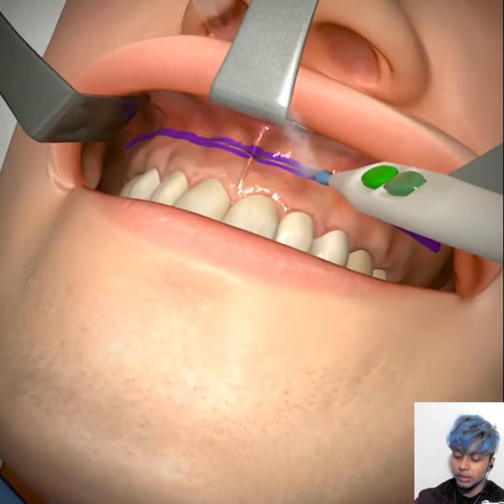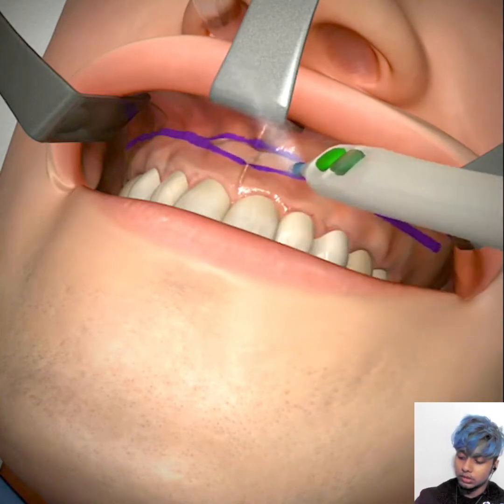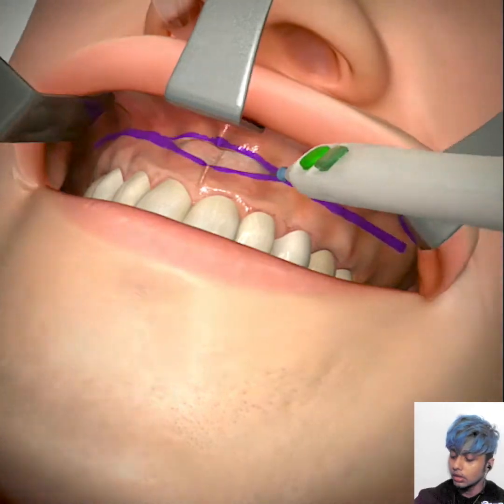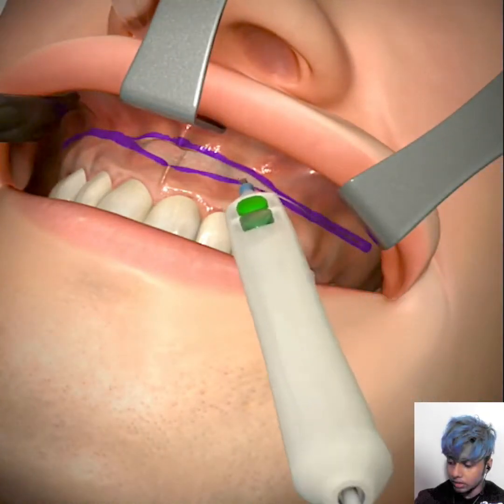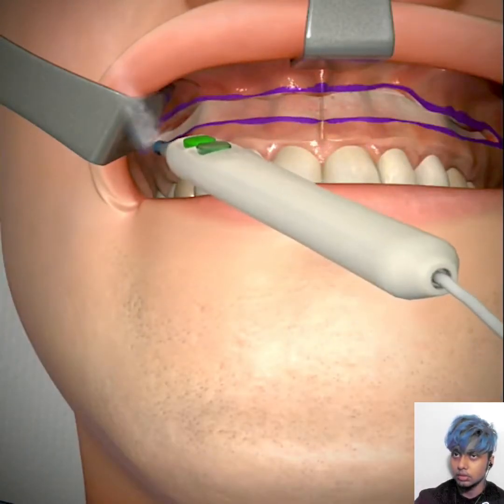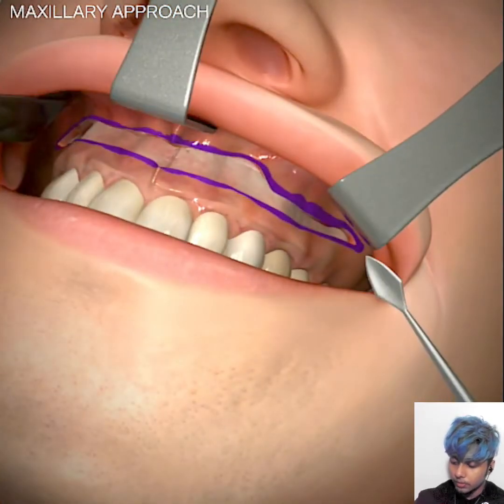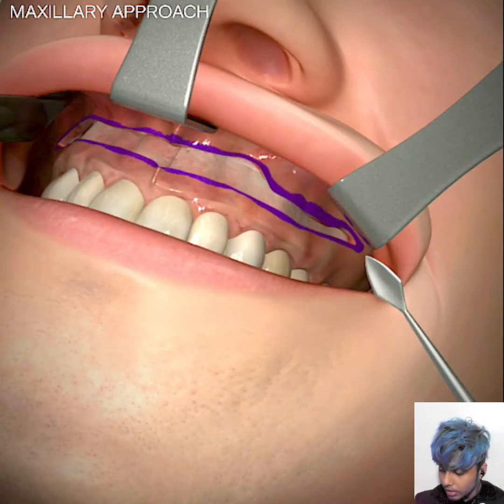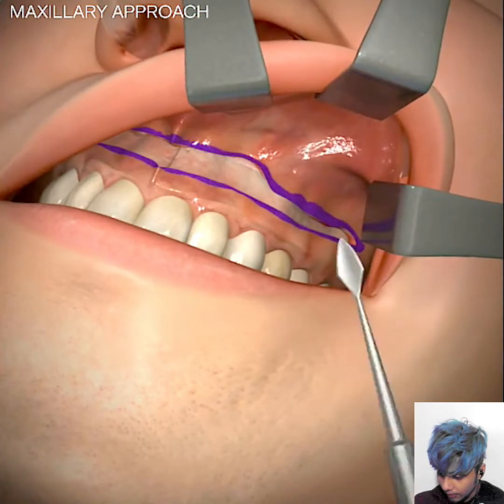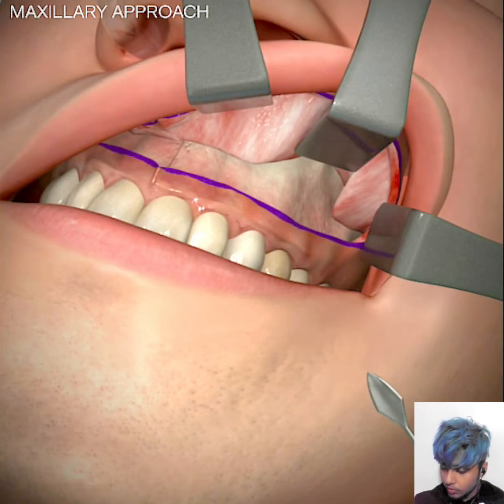We'll start the incision at 5 mm above the teeth and continue the incision through the mucosa, submucosa, underlying facial muscles and periosteum into the bone surface. We will extend the incision properly and then start going through. We will select a sharp periosteal elevator right now and deglove the anterior maxillary wall in a superior anterior direction. We will detach the nasolabial musculature along the piriform aperture.